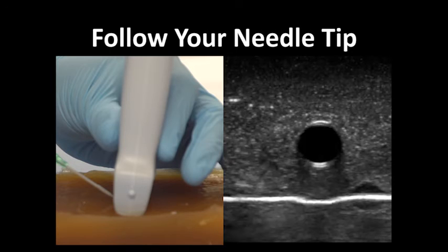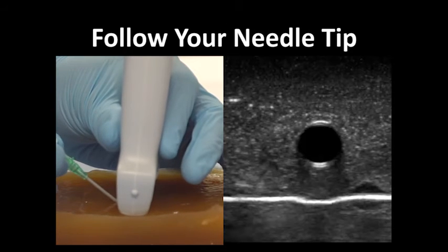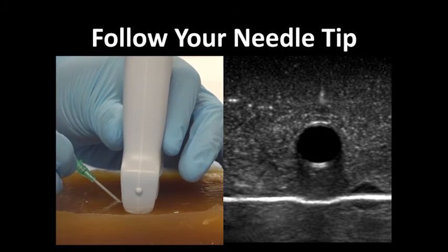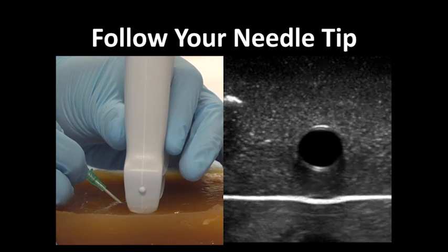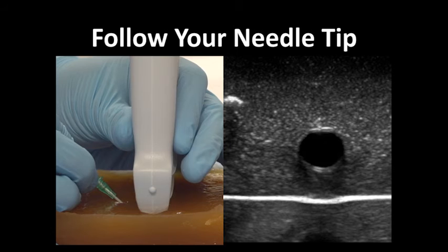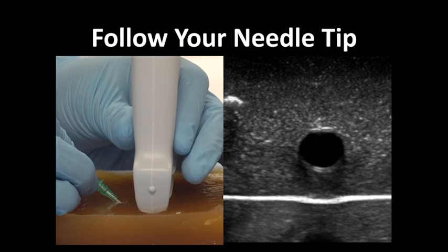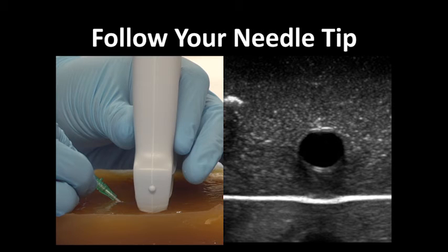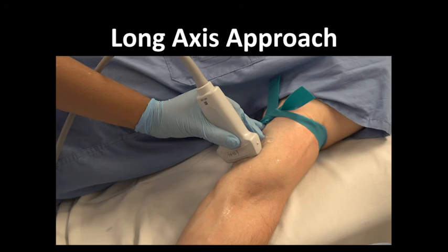The needle tip appears as a hyperechoic, bright white dot that you will need to follow closely as you insert. Because the needle tip may appear exactly the same as an ultrasound cross-section of any portion of the needle, it is important to continue moving your probe proximally and follow the needle tip as it approaches the vessel. If you lose your needle tip, remove the needle almost to the surface and start again. Never advance the needle if you cannot visualize the tip on the ultrasound screen.